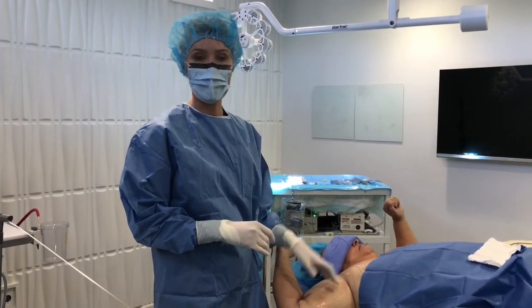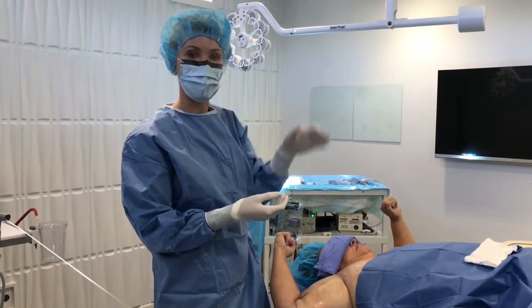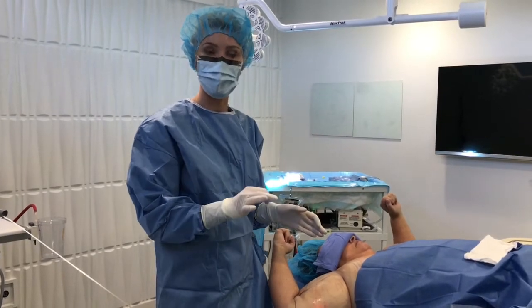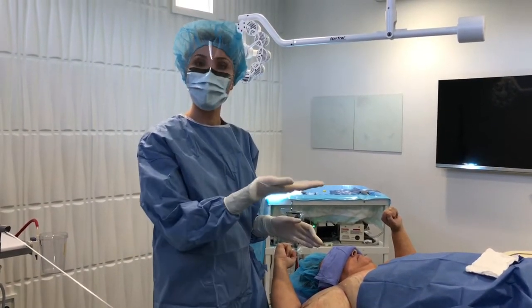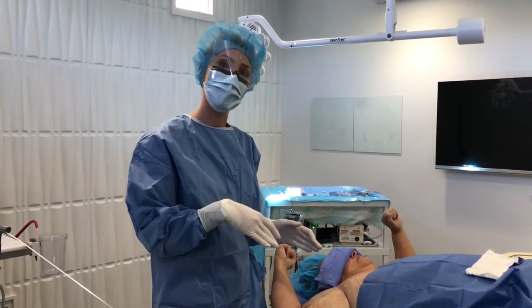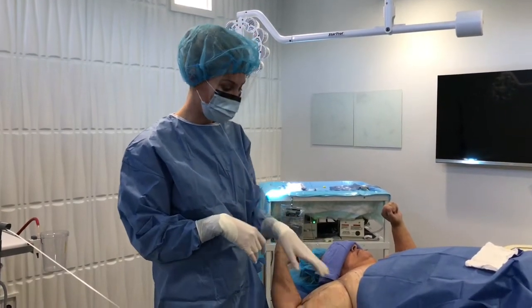We've got a patient here that has had some skin laxity in the upper arm area, and so we do kind of a two-step procedure. The first part is actually introducing AcuSculp, which is an Nd:YAG laser that emits light energy that helps tighten the skin and melt some of the fat, and then I'm going to follow along with liposuction after I do the laser treatment.